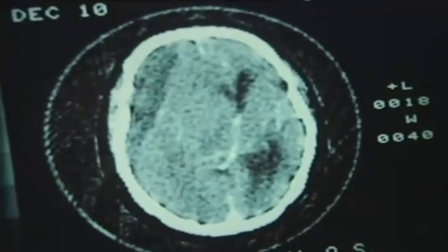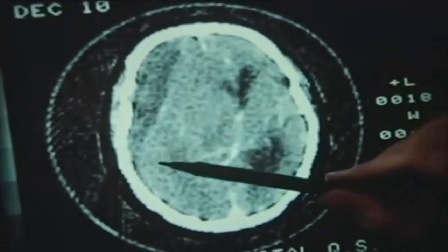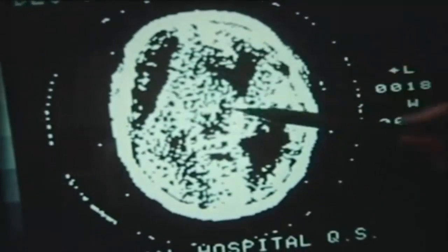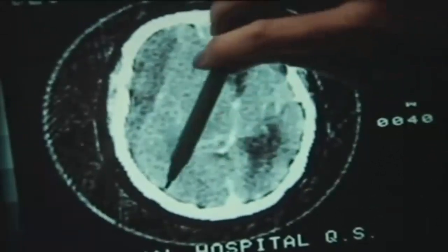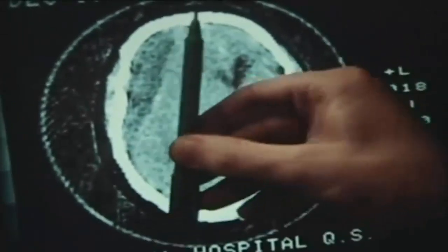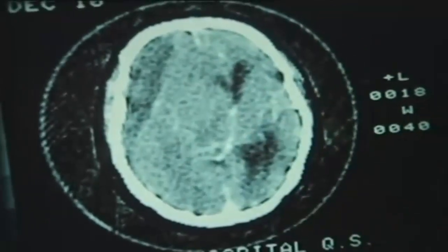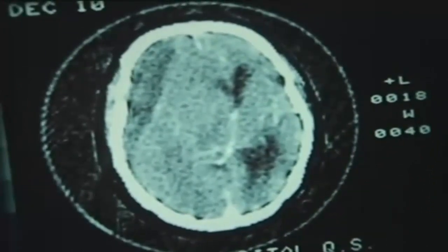This was an alcoholic who fell in the street. You can see here this large collection of blood, which is less dense than the brain. It is displacing the ventricles away to one side and compressing the whole of the brain, expanding in this region. This is a life-threatening blood clot.